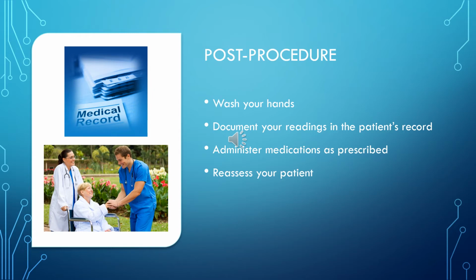Post-procedure, you need to wash your hands and then document your readings in the patient's record. Again, as we spoke earlier, if there are medications prescribed for hyperglycemia, if your test reading comes back high, follow these orders and administer the medication as prescribed. And as always, before you finish anything, you need to reassess your patient.